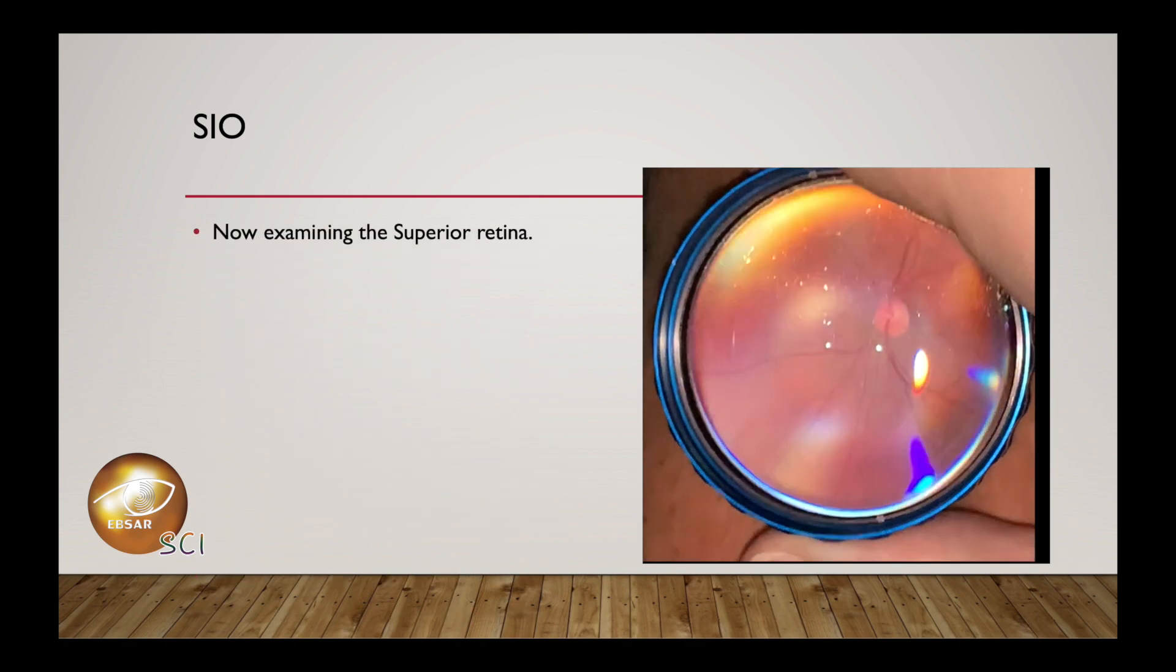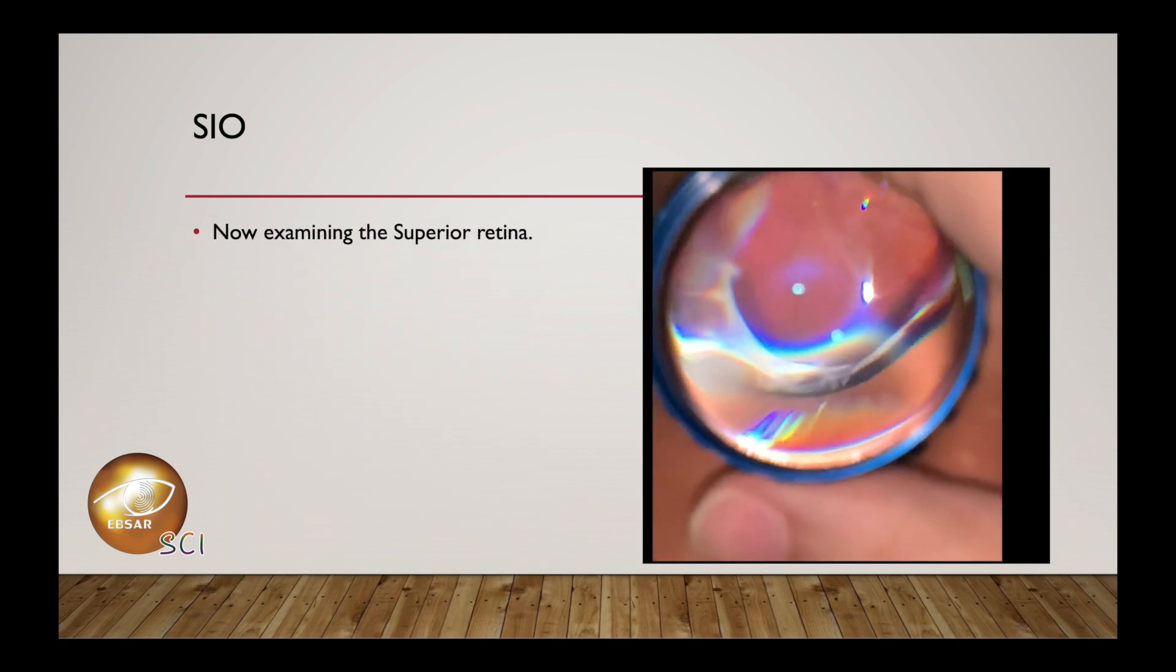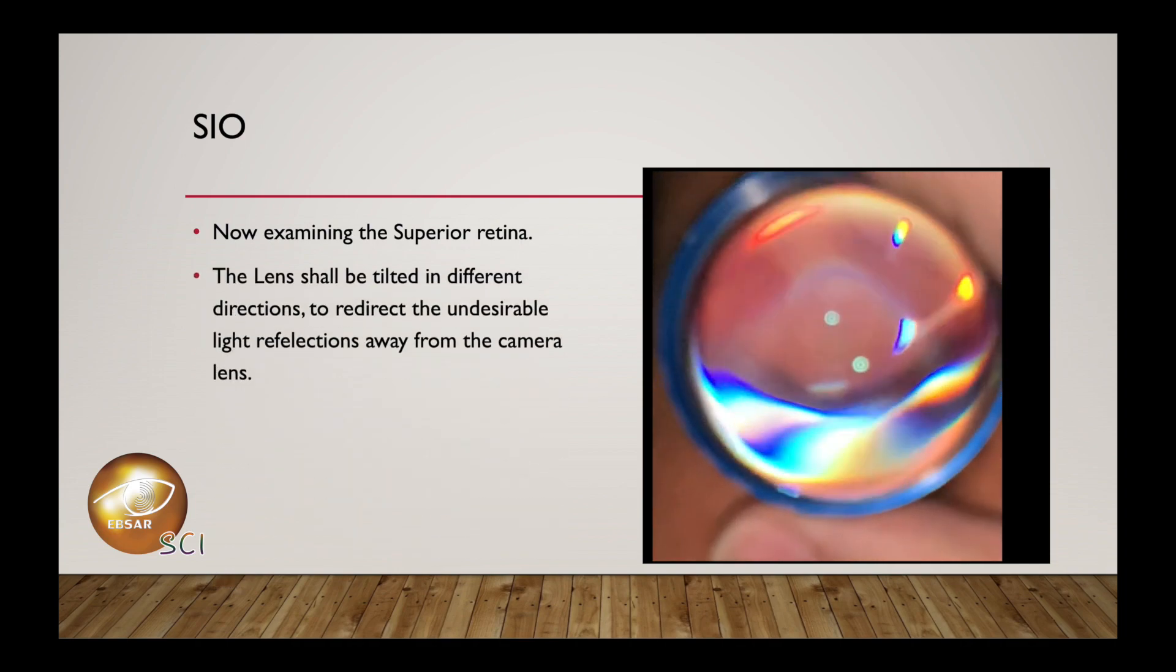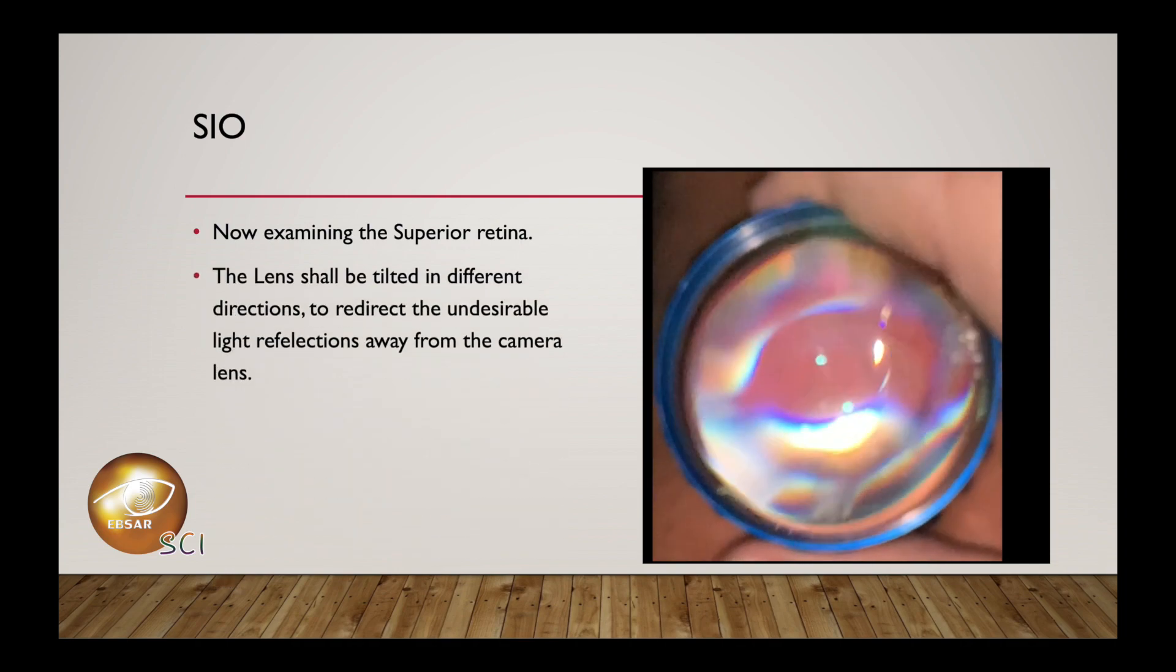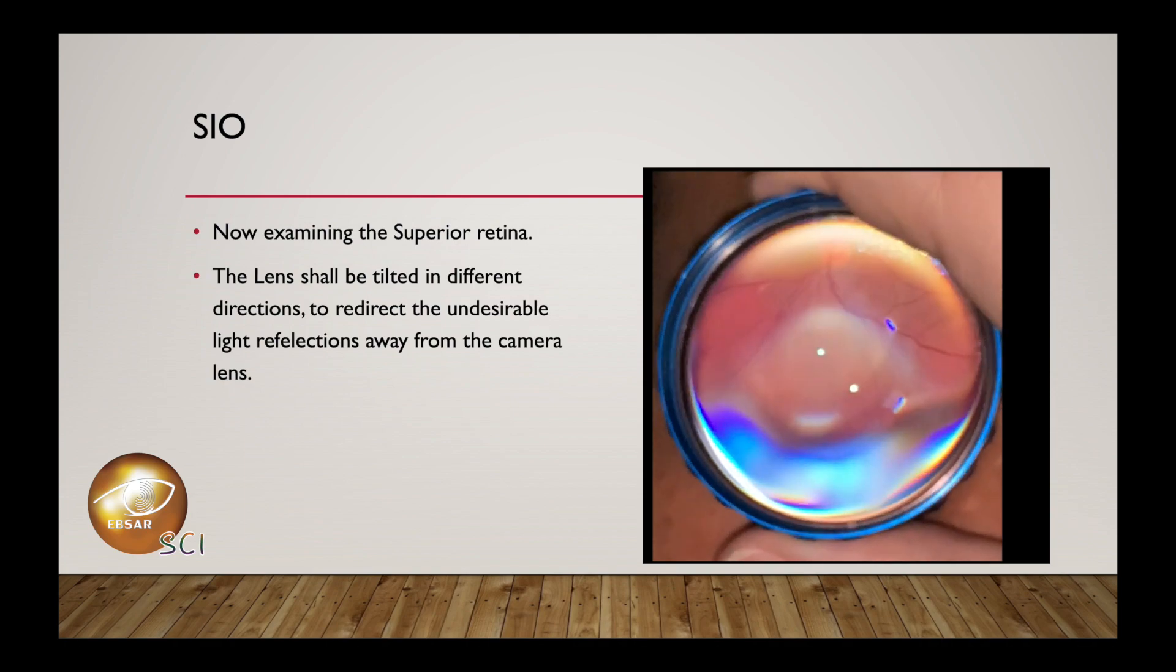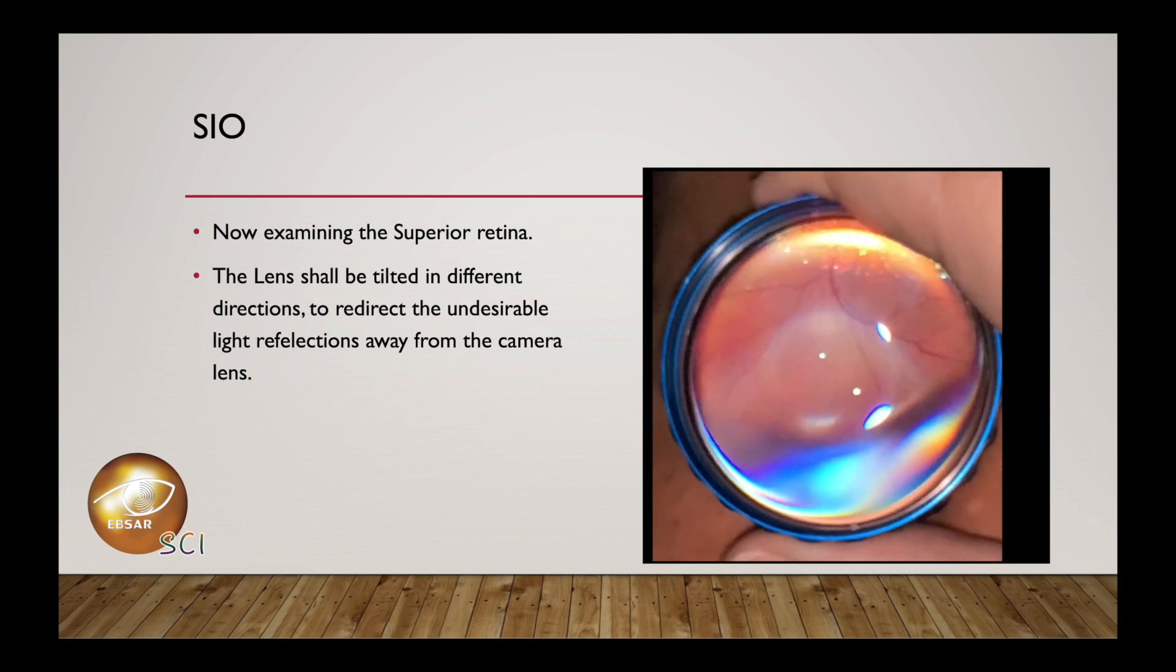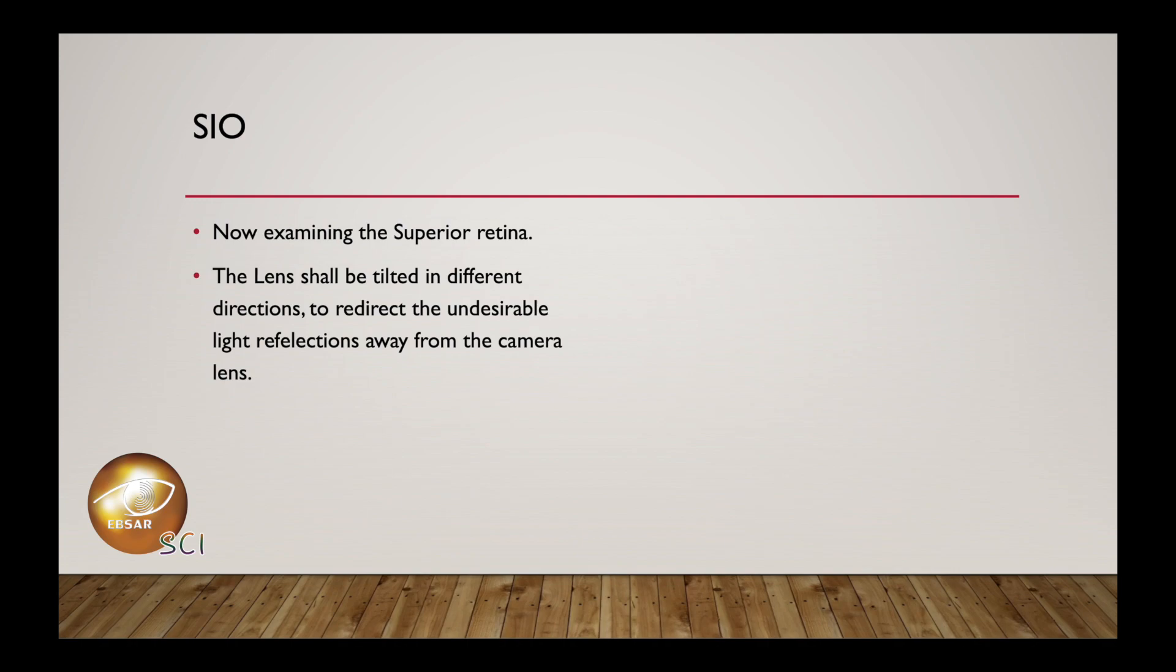Now examining the superior retina. The lens shall be tilted in different directions to redirect the undesirable light reflections away from the camera lens. As clarified here, each side should be brought front and back to adjust the lens reflections.